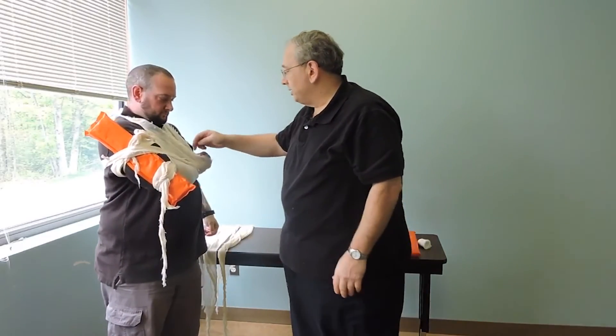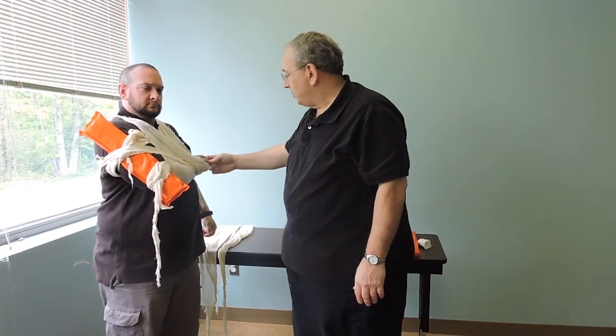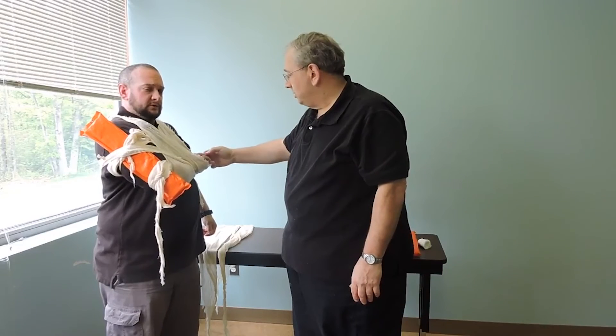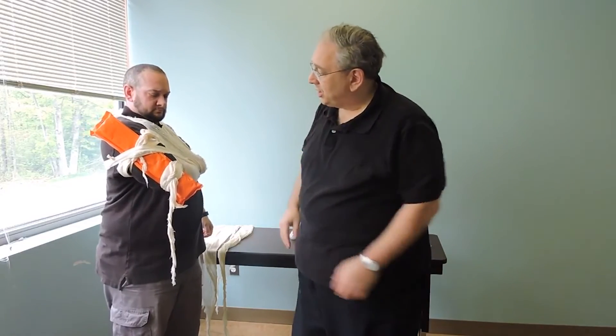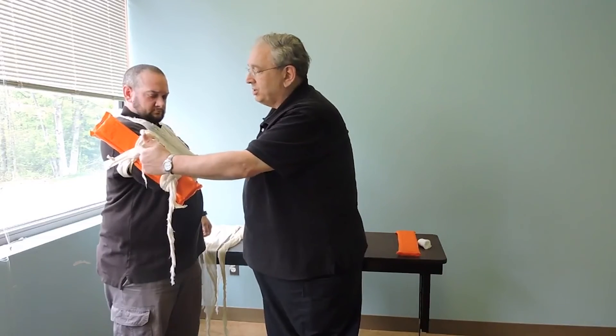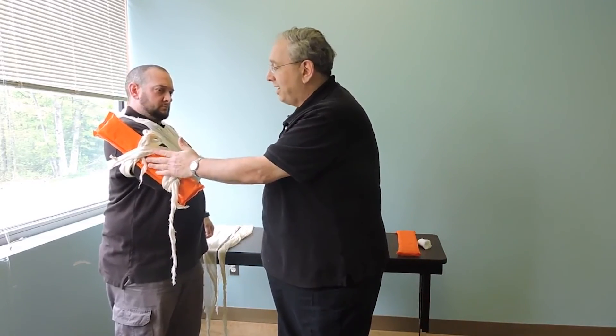I'm going to make sure that my patient has good pulses, good sensation and motor function. Can you feel me touching? And I'm going to check capillary refill. This is secured. While it looks like this is over the break, it's actually against the board, so it's fine.